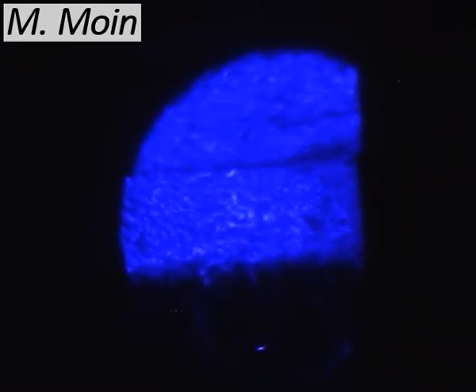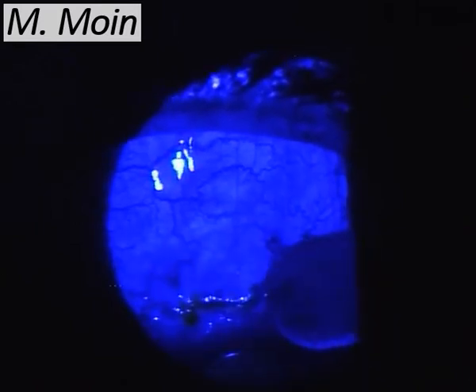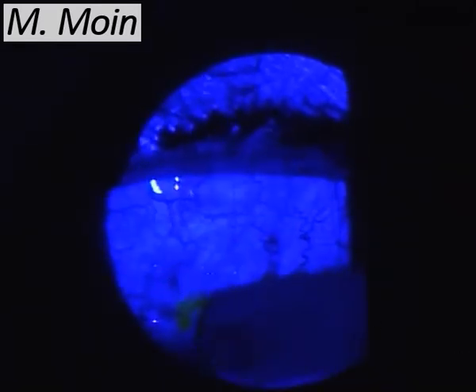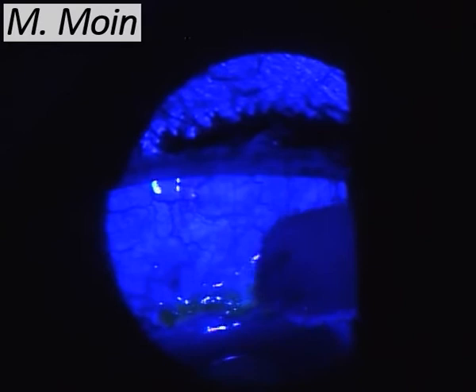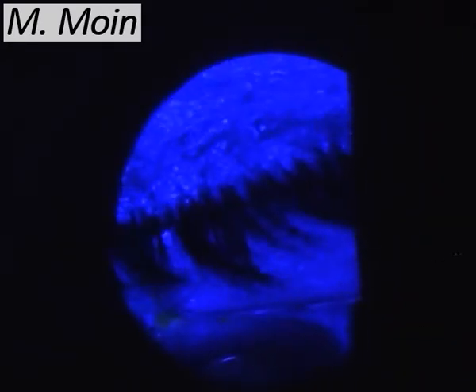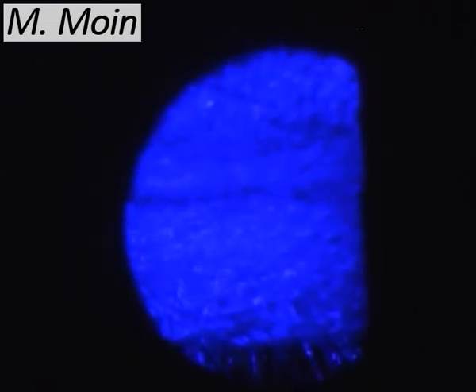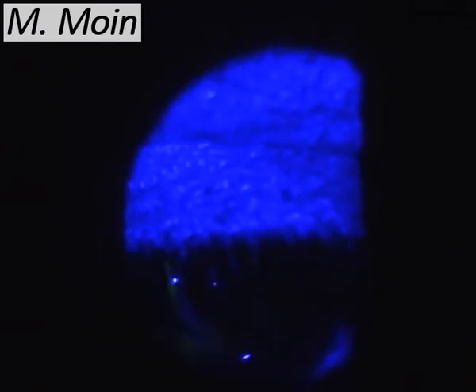So the important test we're going to do is the Seidel test. So put local anesthetic. I'm putting fluorescein dye. I just use a sterile fluorescein strip over that area, and ask the patient to blink, and then you will see if that tends to get diluted or not. So this patient did have a mild Seidel positive test.